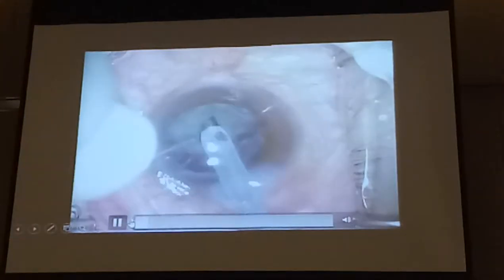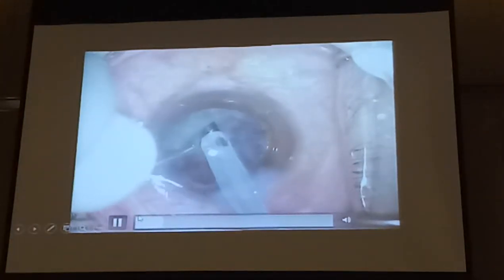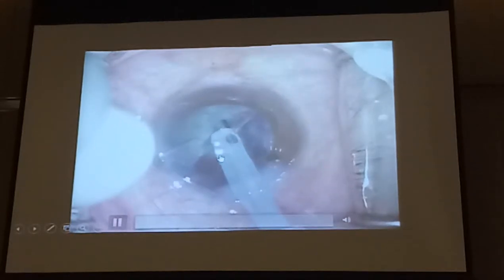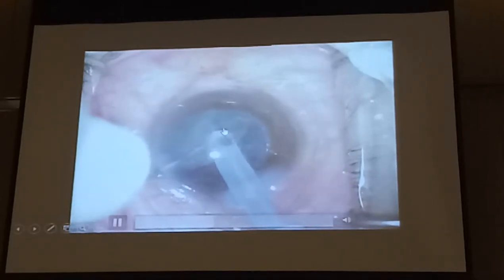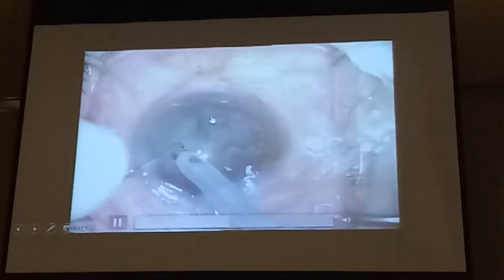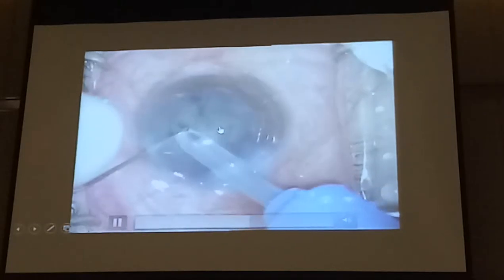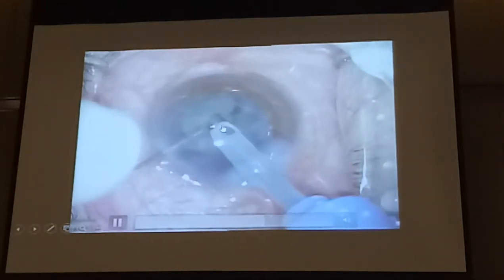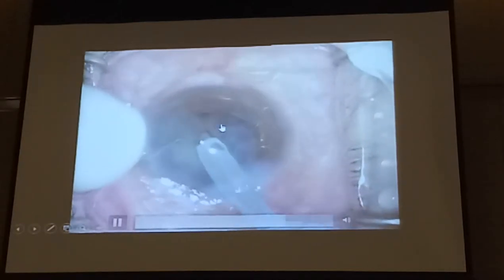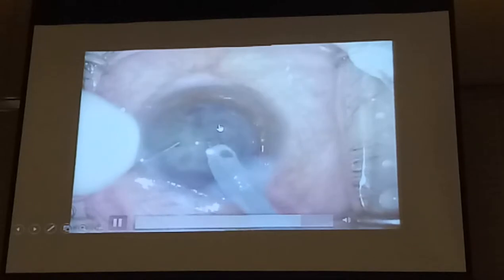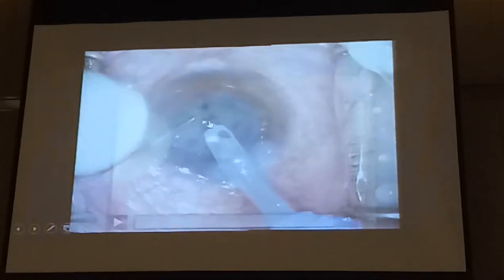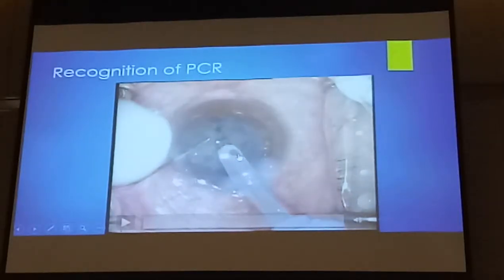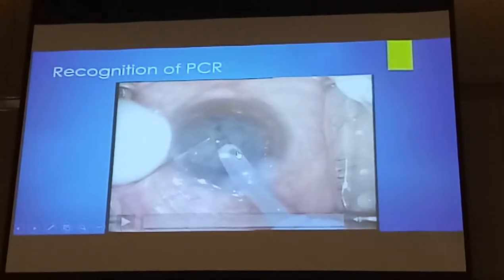Have a look at this case. Again, this is a soft nucleus. Watch the fluttering. The surgeon is going right through. Did you see the fluttering? The PC is probably gone already with that maneuver. The surgeon can still rotate the nucleus. Did you see that bounce? Definitely the PC has been violated. The surgeon realizes that something has happened. But you see all the signs — it is bouncing. When you rupture a capsule, you get a sudden bounce and then it flutters.